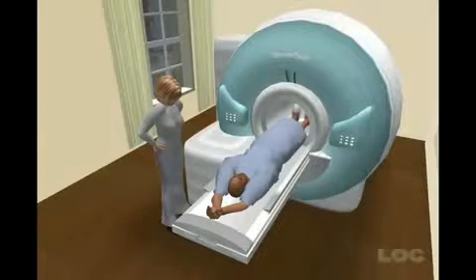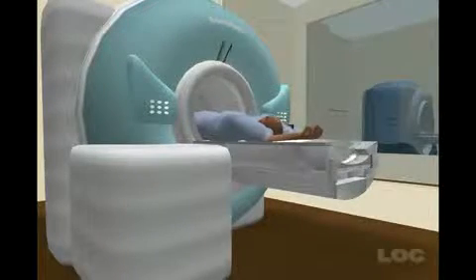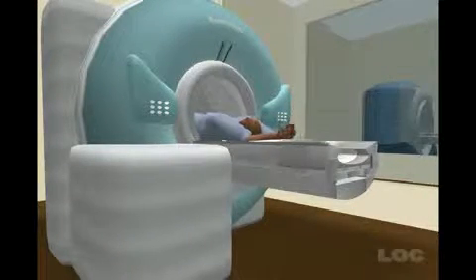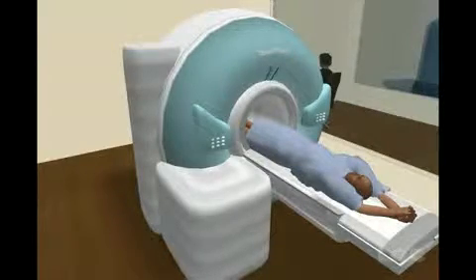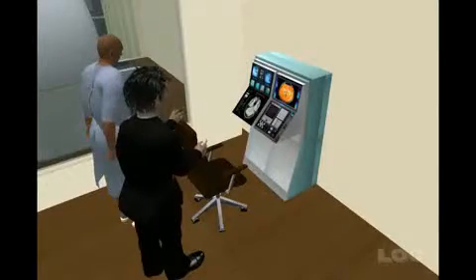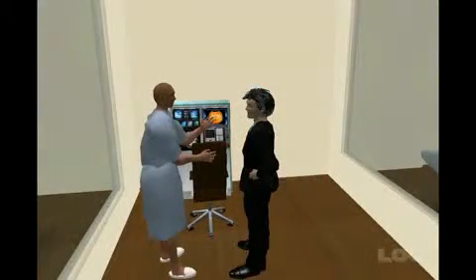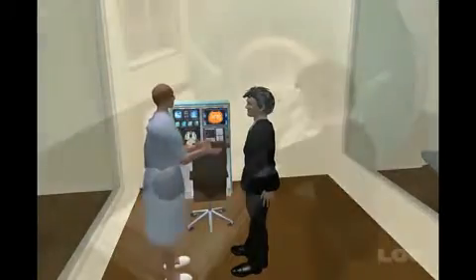The radiographer will give you a button on the end of a wire, so if you have any concerns, you can immediately alert the staff. You can also talk to the nurses or radiographers while you're in the scanner. As the scan uses magnetism, you'll need to make sure you've removed all metallic objects. You'll also need to tell the radiologist if you have any internal metal objects, such as a pacemaker, or if you have any surgical clips.